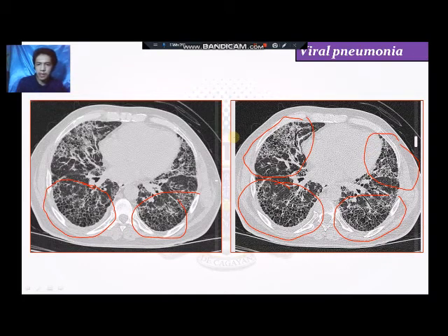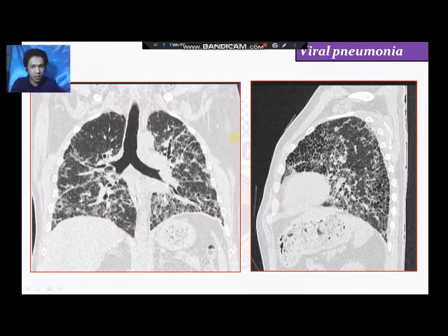Okay, so if you try to search for images related to COVID-19, their CT scans and X-rays have almost the same appearance as viral pneumonia. What happens in the lung tissues of our patient is inflammation related to fluid accumulation. Okay, so if there is a lot of fluid in the lung field of our patient, later on breathing will become difficult. So this is the bronchial tree of the patient.